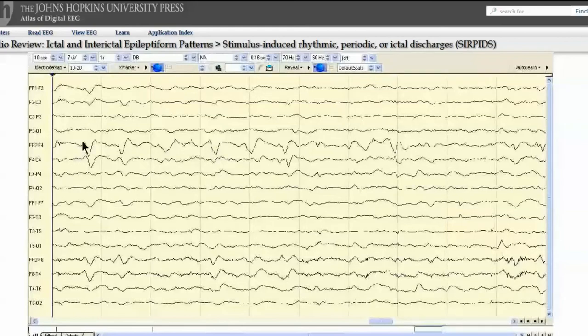On this page, again, you can see the clear epileptiform morphology is sharp and slow wave. Here, the sharp component is upgoing, as it is, in fact, in the next derivation, suggesting that this is an end-of-chain phenomenon in which there is no phase reversal to help with the determination that this is epileptic in nature. This upgoing component here indicates that at FP2, the discharge is surface negative, the negativity appearing in the first electrode of this electrode pair.